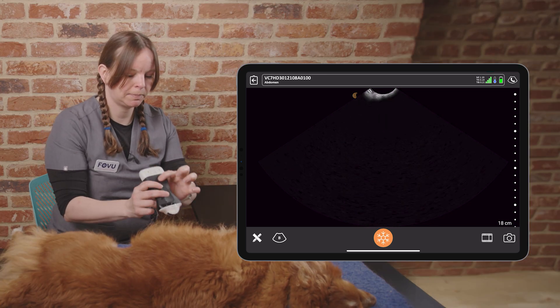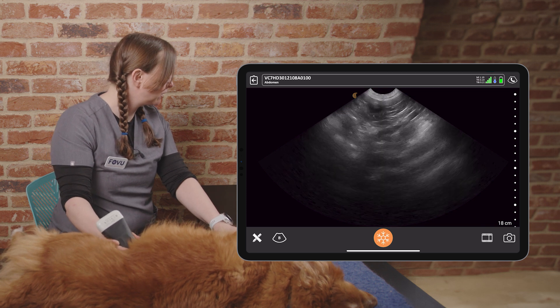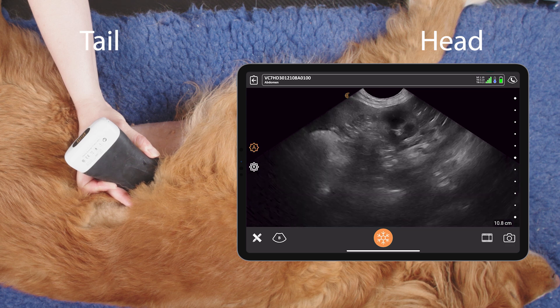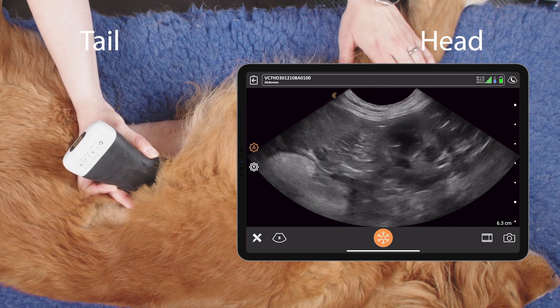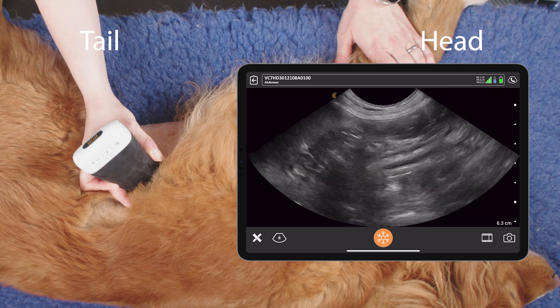The next view is the splenorenal view, so we go into that top left quadrant where we find our spleen and our kidney, and we want to reduce our depth a bit here. And again, we rock and we fan in this region.